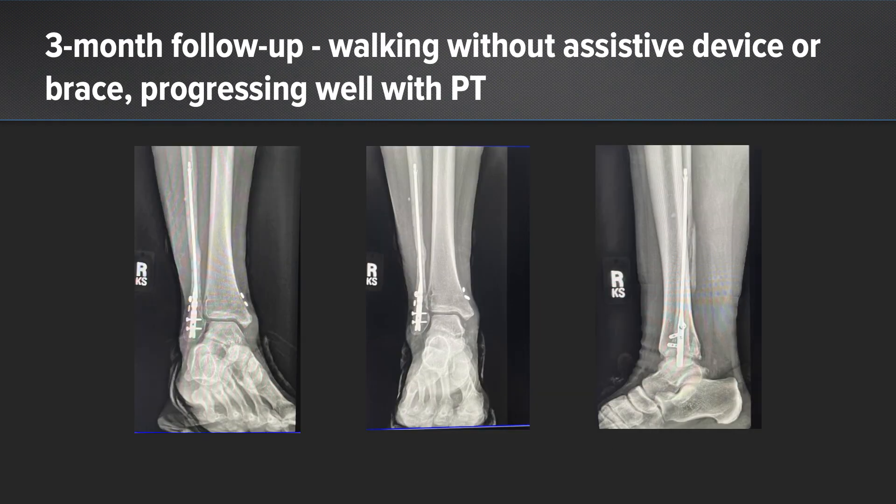Here she is at three months. She is currently walking without assistive devices. She has active dorsiflexion to 15 degrees and good plantar flexion. She has abundant callus formation — you can see secondary bone healing on these x-rays, which is something you don't see with plate and screw constructs on the fibula — and she and I are both happy with these results thus far.